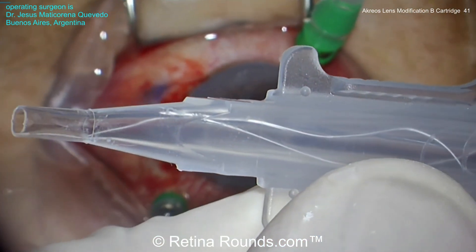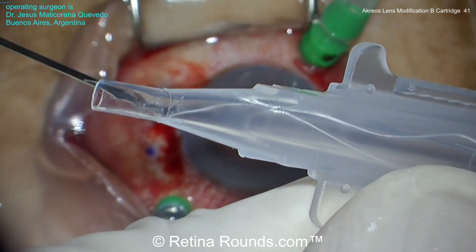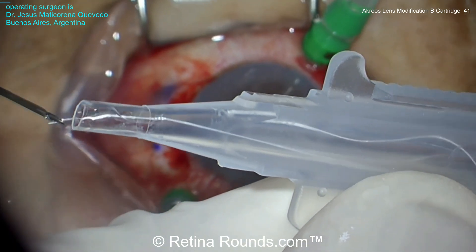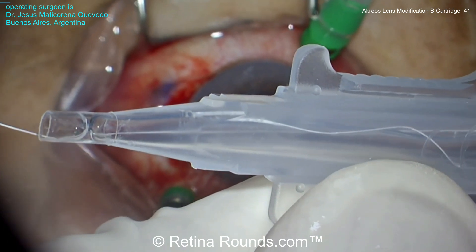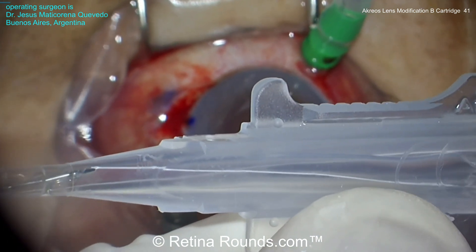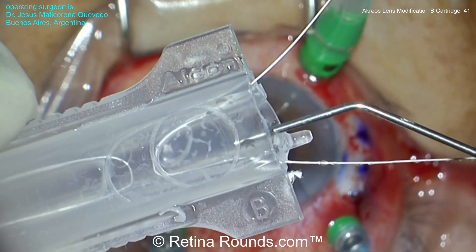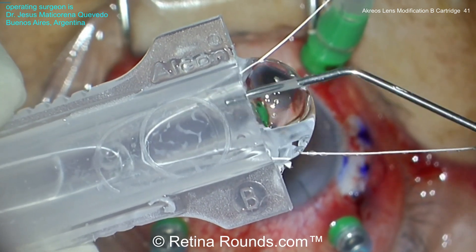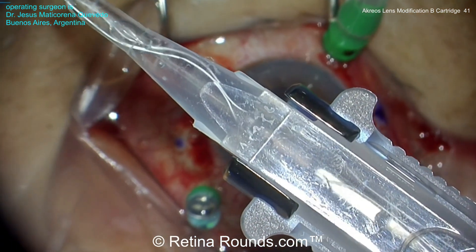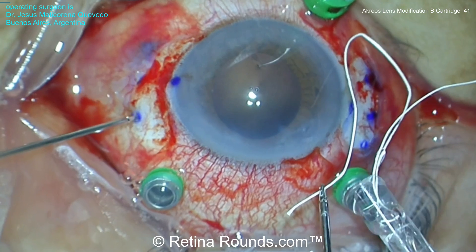Now, using the B cartridge IOL injector, the Gore-Tex suture from one side of the IOL is threaded through the cartridge. It's important to keep these Gore-Tex sutures straight so that they don't get tangled and potentially go into the wrong externalization sclerotomy. Some more viscoelastic is put in the injector and the IOL is advanced. You can see that that IOL folds nicely into the B cartridge.